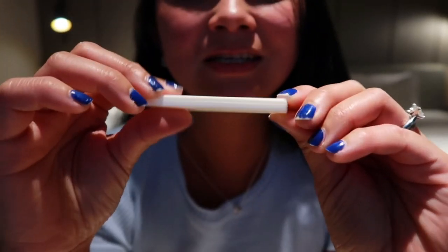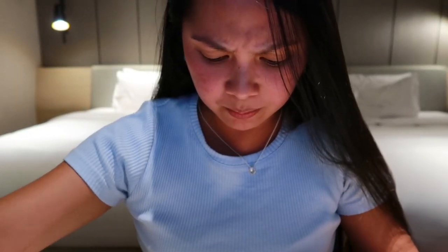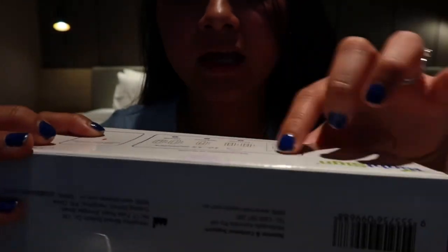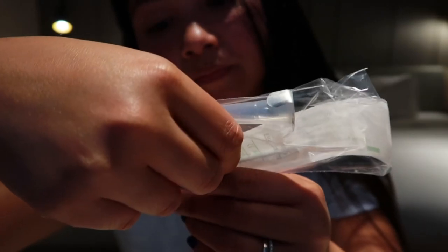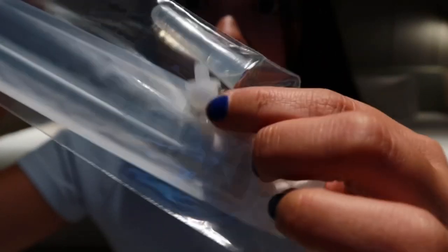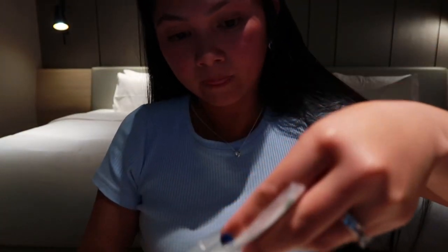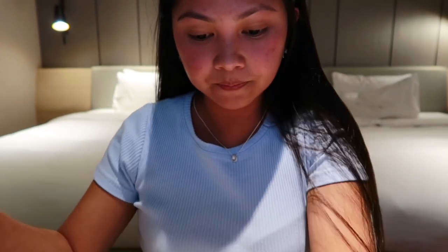It's actually like a pregnancy test! That's how it looks. Then it says insert the prefilled buffer tube into the hole on the kit as marked. So this is the box and there's a hole where you can insert the tube. I'm going to get the tube and open it up.